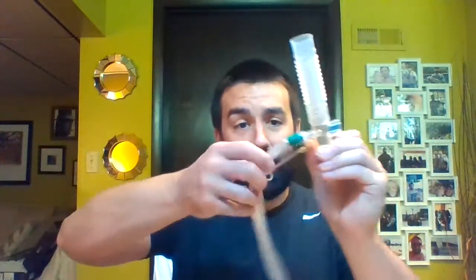All right, as you draw back, if you had a bunch of gunk on here, you got a little lavage port. So you can hook a 10 cc saline flush or a little pink squirt. Slowly advance saline through as we're pushing our finger on the thumb control port, and that kind of clears that thing up and out of there. And then making sure you put that cap back on, otherwise you get a leak from the ventilator. Okay, making sure you don't pull that thing back too far. You shouldn't see that big black line all the way right there. Okay, if you pull it back, it fills up like a balloon. Likewise, making sure you don't leave it down in that patient's airway can add on to the resistance.